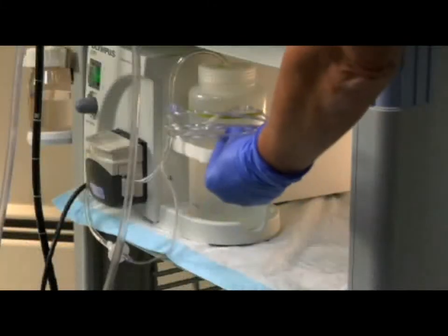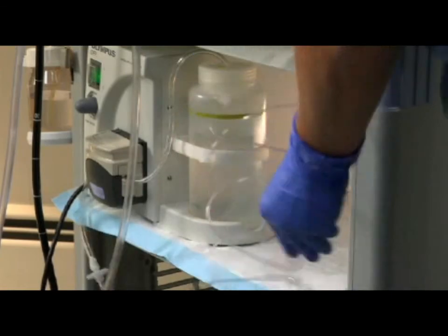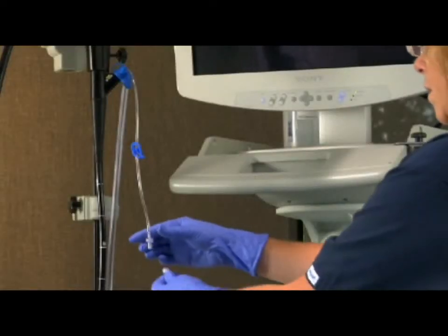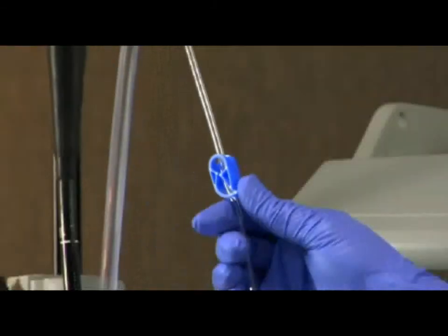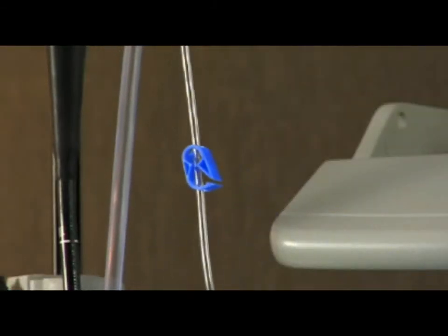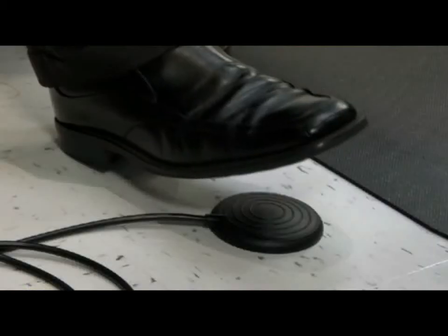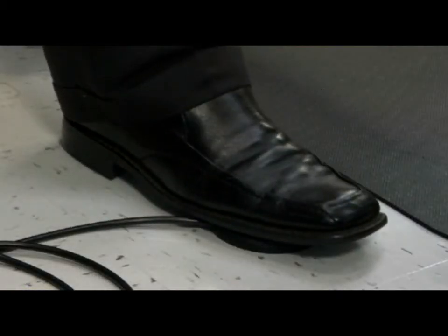When using a water pump for irrigation, the nurse will connect the water pump's tubing to the BioVac device's irrigation line. Open the blue pinch clamp on the BioVac device's irrigation line. The physician can control irrigation by operating the foot pedal on the water pump.